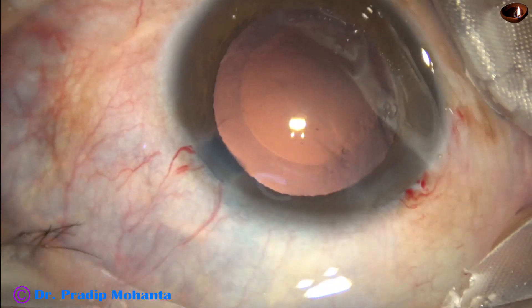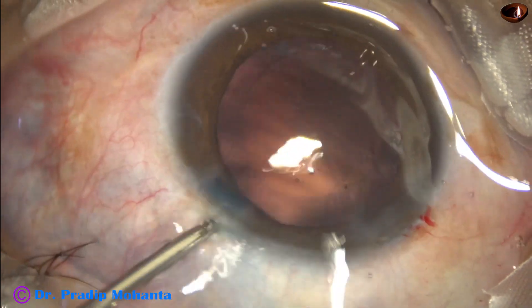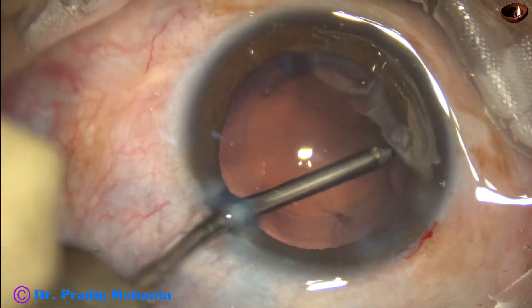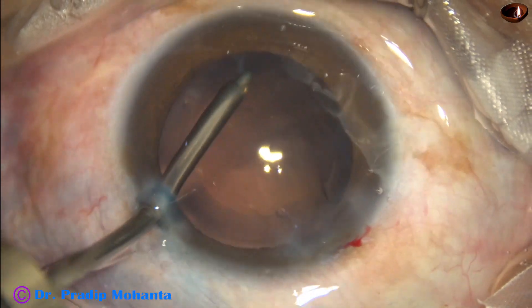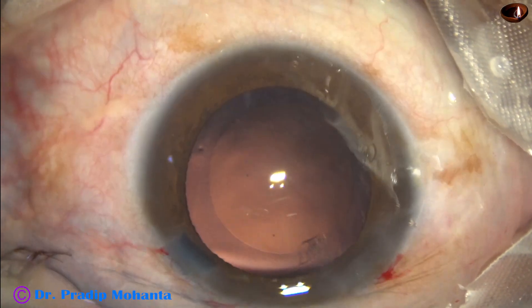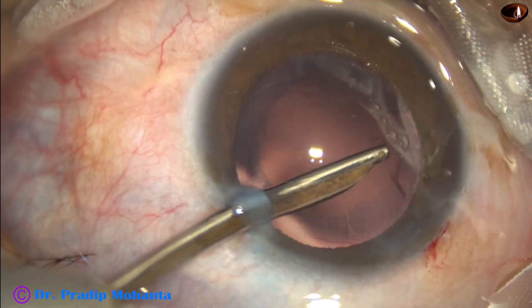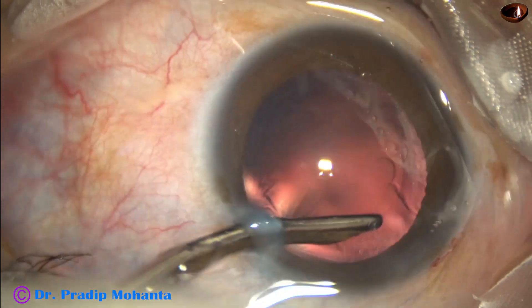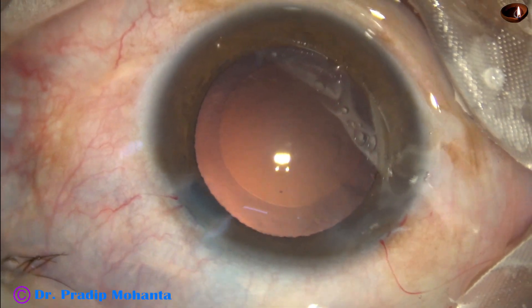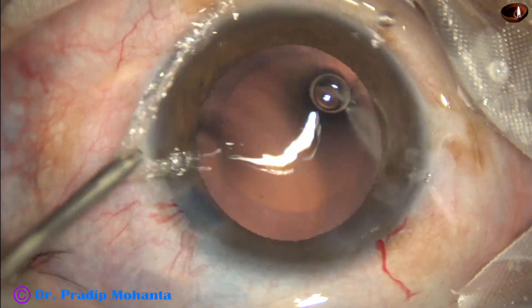Now is the time to implant an intraocular lens. Before this, there are some cells sticking to the posterior capsule just in front of the main wound, so I go again and remove the cortex. Now it is done — the posterior capsule is clean with no cells sticking to it.